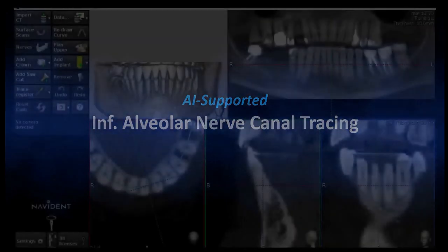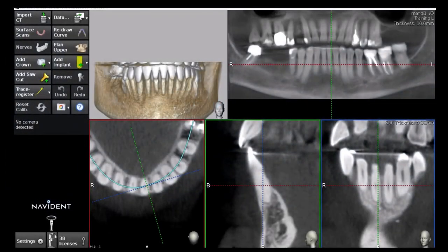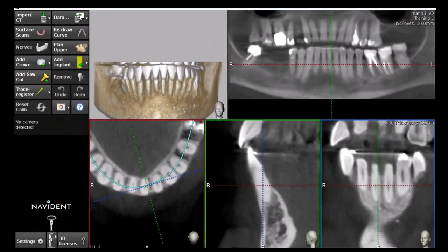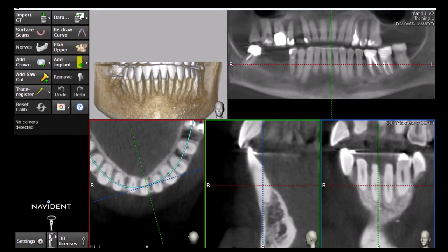Upon importation of a mandibular CBCT, the inferior alveolar nerve canal is automatically detected and segmented. During this process, the nerve button in the side panel is grayed out and inactive. Once the process is completed, the button becomes highlighted — click it to review the result.